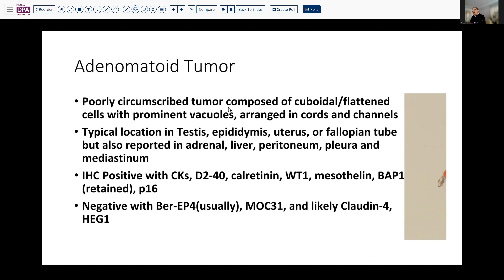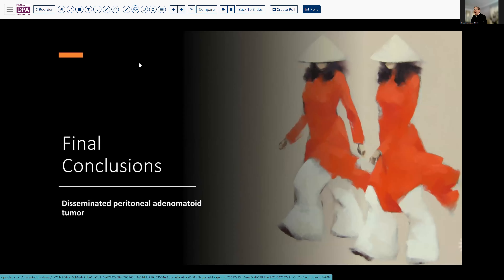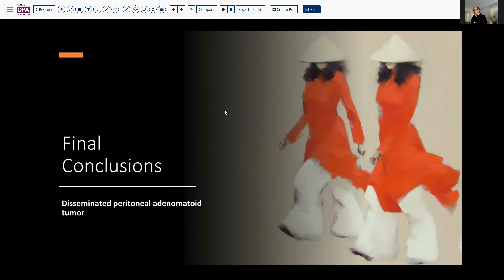To the degree we had sufficient tissue, we were able to demonstrate that this was positive with WT1, positive with mesothelin, and with a very low proliferation rate, we made the diagnosis of disseminated adenomatoid tumor.